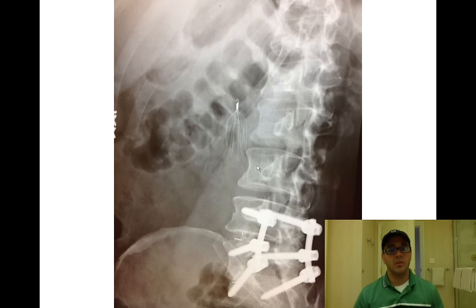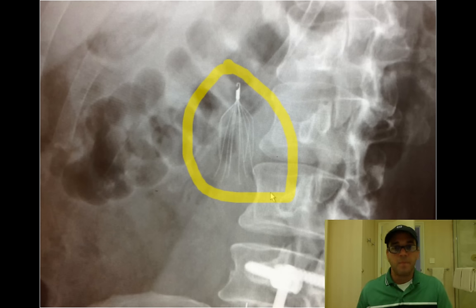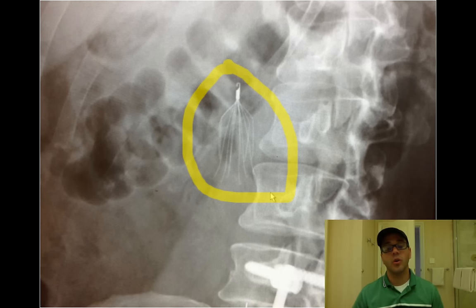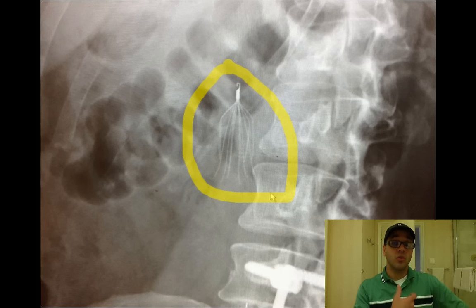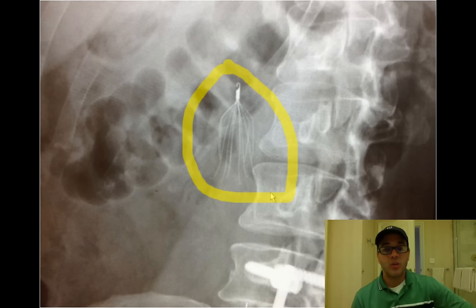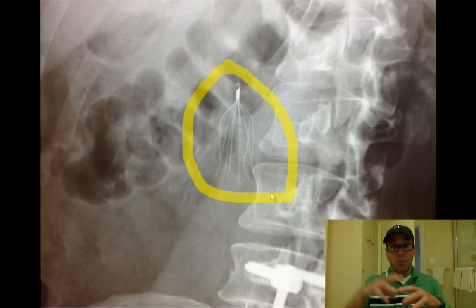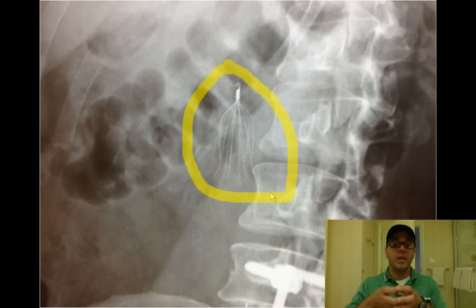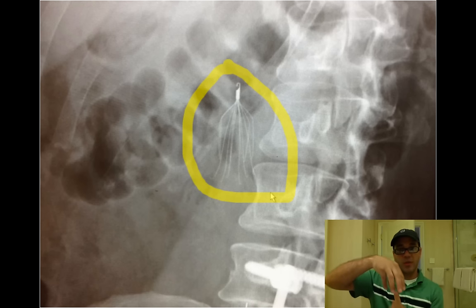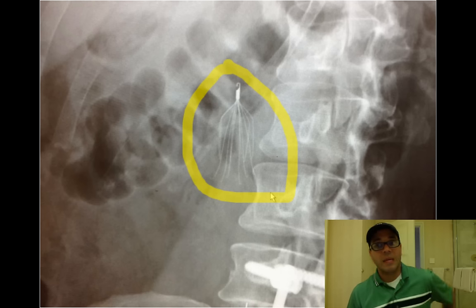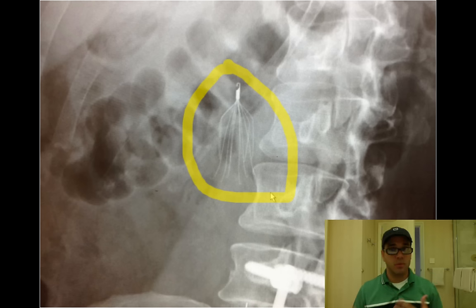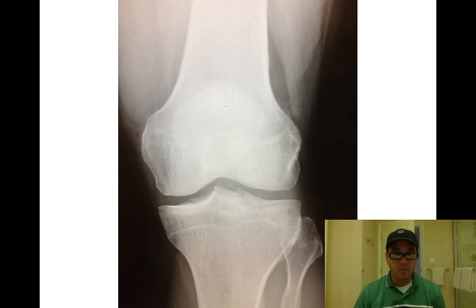This next X-ray doesn't show something necessarily wrong, but I wanted to share what certain things look like. That structure there is called a Greenfield filter. This patient has a history of recurrent DVTs — deep vein thrombosis of the leg — and was throwing clots into his lungs despite being on anticoagulation. A Greenfield filter is basically an umbrella with legs placed in the vena cava, the main vein going toward the heart, so that when a clot travels up it gets stopped before it can become fatal. You can also see some hardware at the bottom of the back from prior surgeries, which likely contributed to the clots.